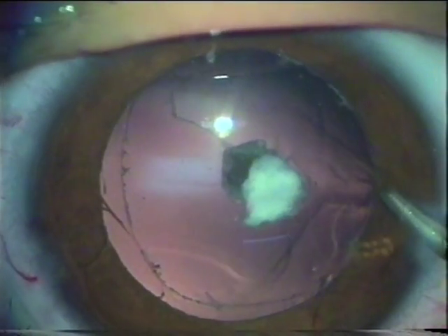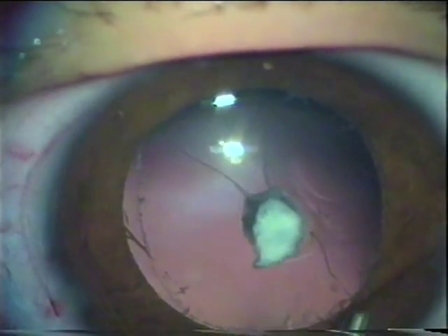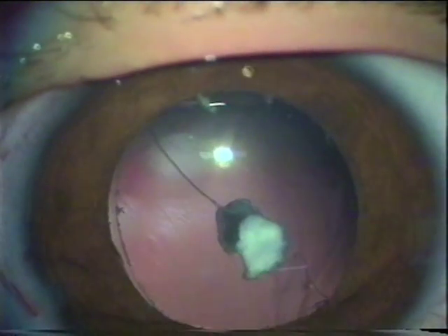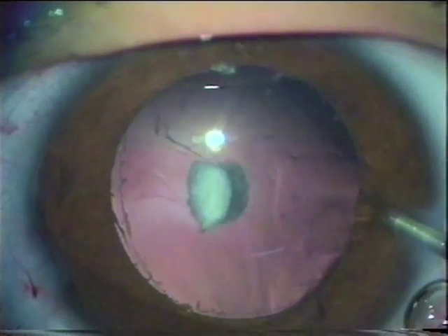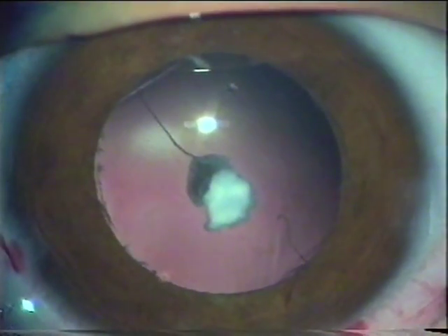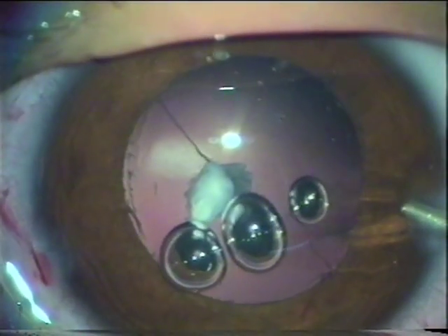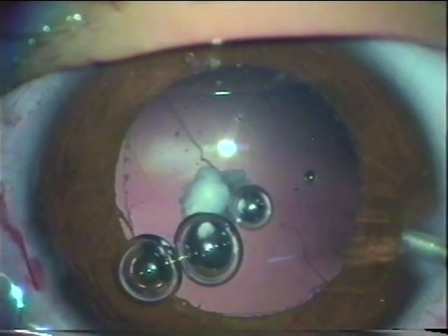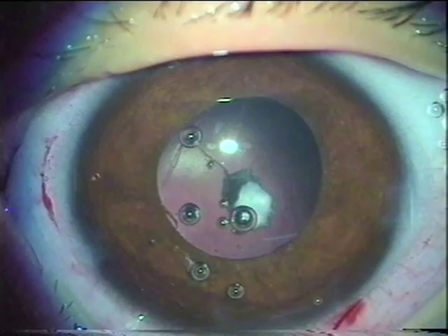The edge of the capsulotomy is clearly seen. Injecting carbachol into the anterior chamber to contract the pupil. Coating viscoelastic — methyl cellulose was being used.